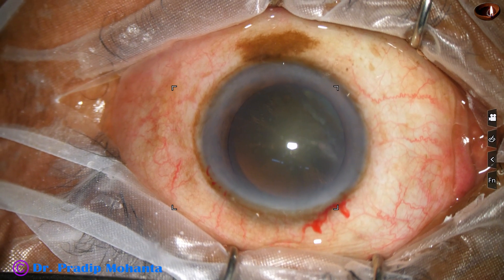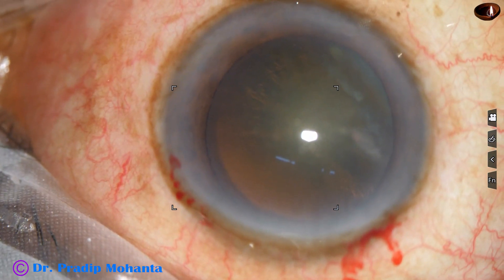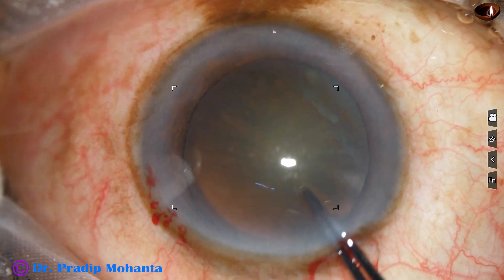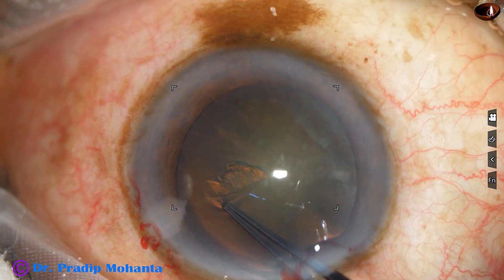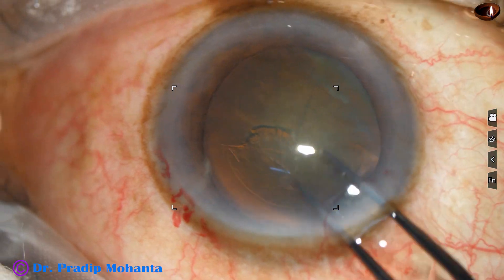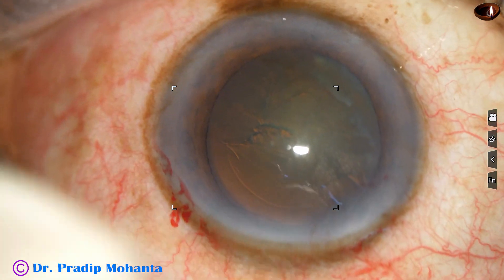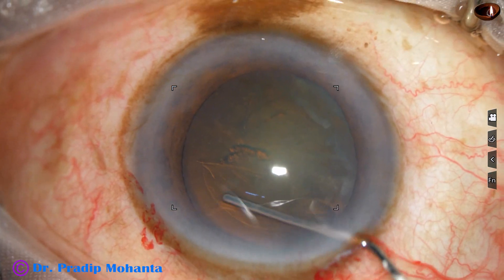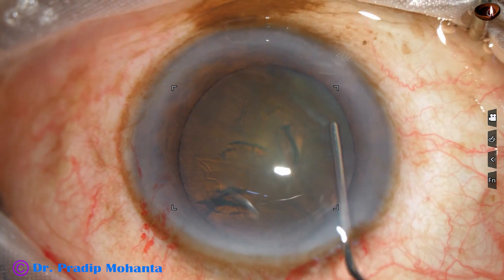Width of this side port is about 1.7 millimeter, and now capsulorhexis is being done with the help of Utrata forceps. The size of this rhexis is about 5.5 millimeter, and now hydrodissection is done with a 27 gauge cannula and a 2cc syringe filled with BSS.